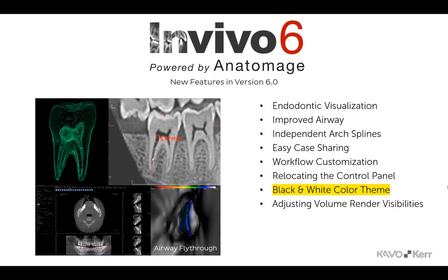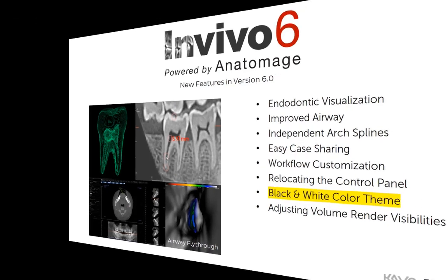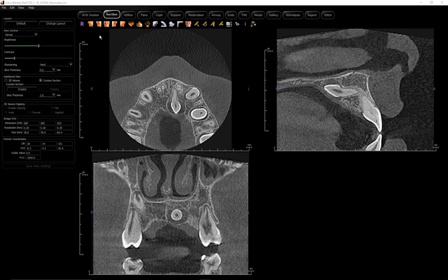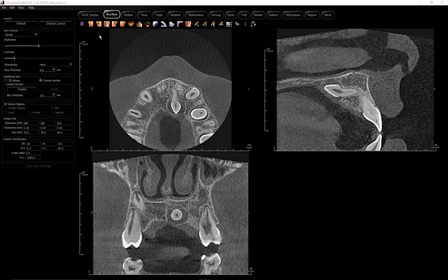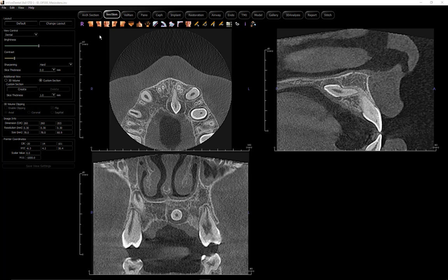A new black and white color theme is introduced in NVivo 6. Two color themes are now available. When you first open NVivo 6, the default theme will be black and white, designed for a radiologist or the doctor that likes a more traditional radiology appearance.